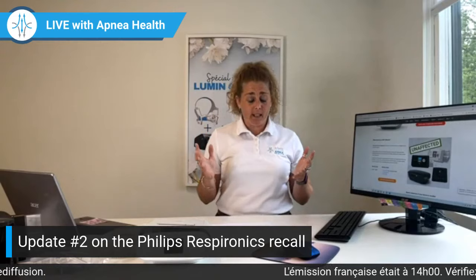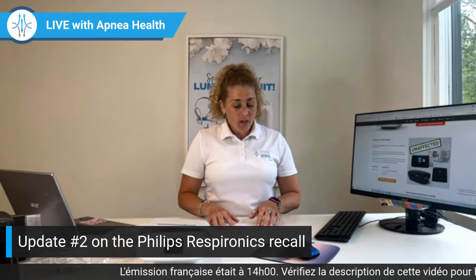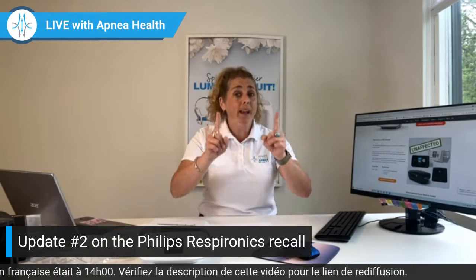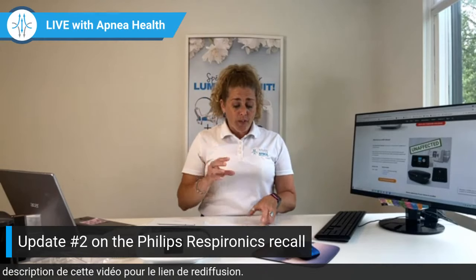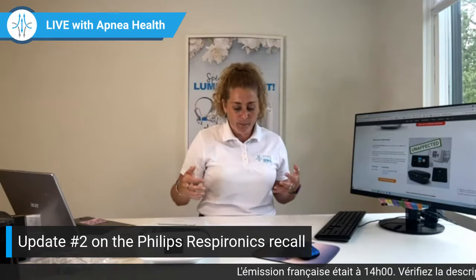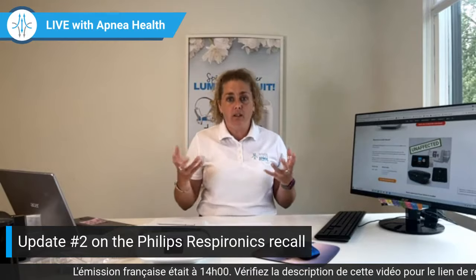Why is this risk low? Let's take a look at this first. The risk of the foam breaking down occurs when, one, you clean your machine with ozone cleaning products, like the ones you see advertised on TV by William Shatner. Those endless TV commercials you see all the time.